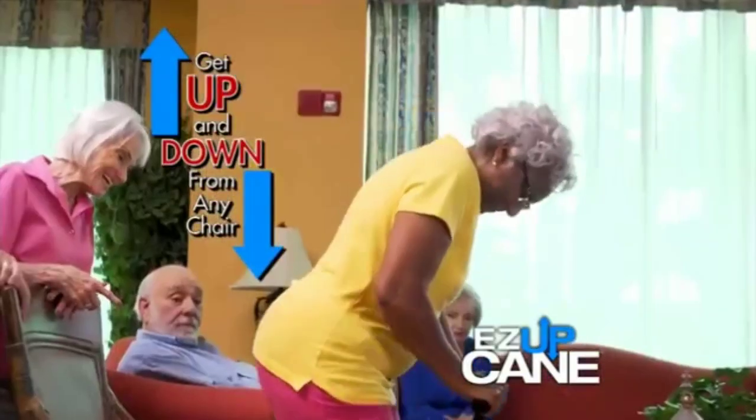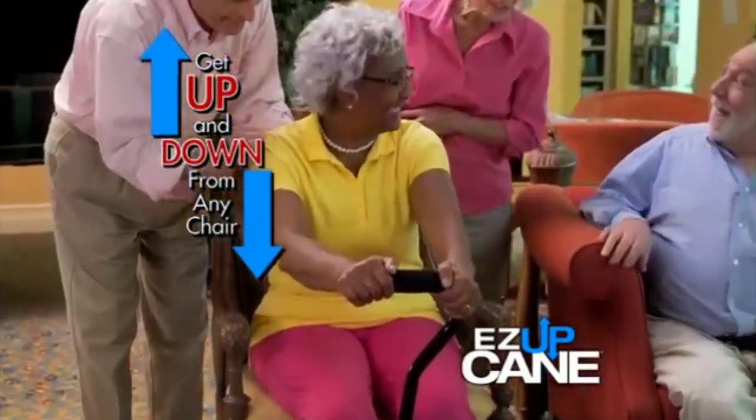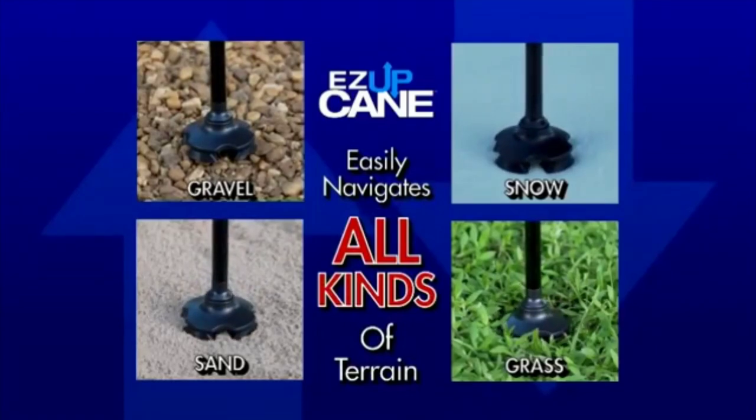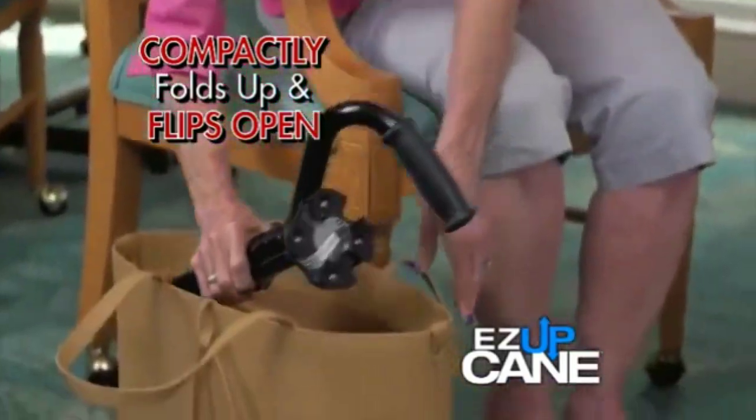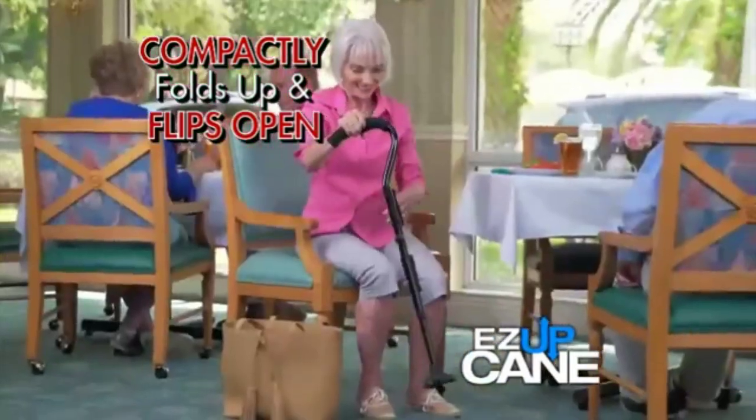Easy Up Cane not only helps you to get up, it also helps you to sit with ease. Its quad traction base easily navigates all kinds of terrain, it stands on its own, easily adjusts to the height you need, and compactly pulls up and flips open and is ready when you need it.